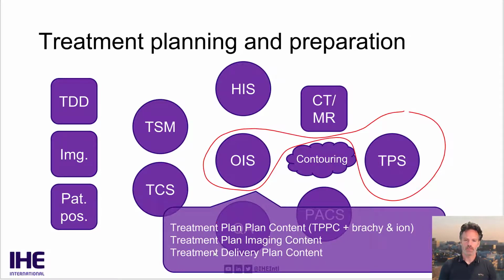And there's also the treatment delivery plan content. This includes other information such as setup instructions and setup images and other information necessary to perform the treatment. Gating instructions are included in that as well.